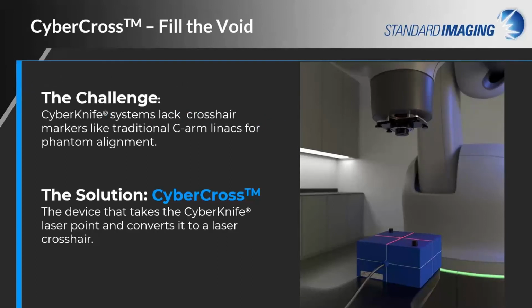Well, as CyberKnife users or potential customers know, this system is not equipped with a crosshair marker of any type, as the system uses fiducial skull or spine tracking for positioning. However, the system is equipped with an internal laser, which the CyberCross converts to a crosshair.